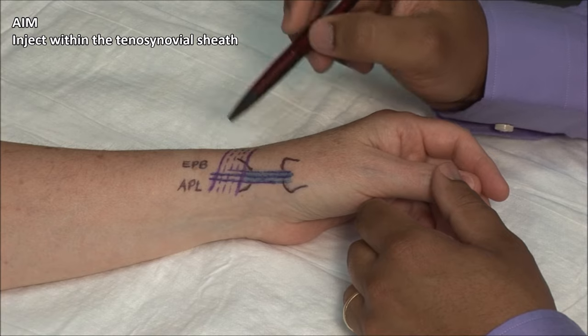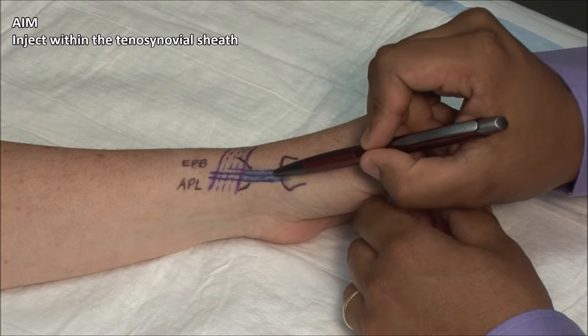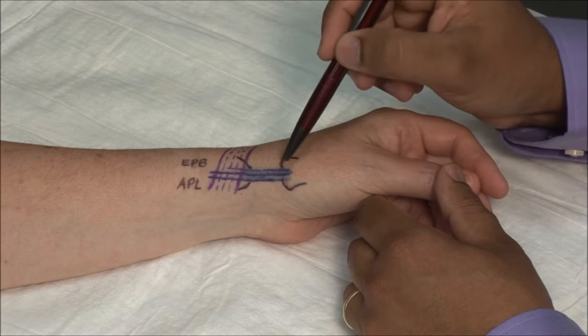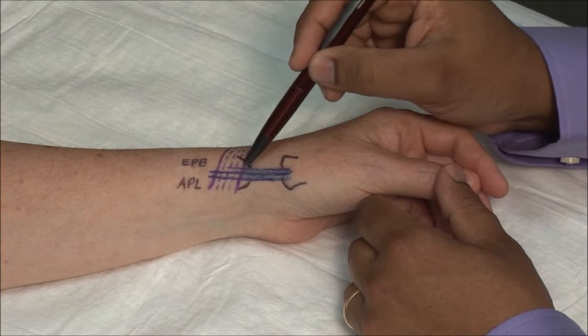The aim of the procedure is to inject within the tenosynovial sheath by sliding the needle just alongside or between the tendons. The entry point is about 3 cm proximal to the first CMC joint, as indicated here, in the area of the radial styloid.